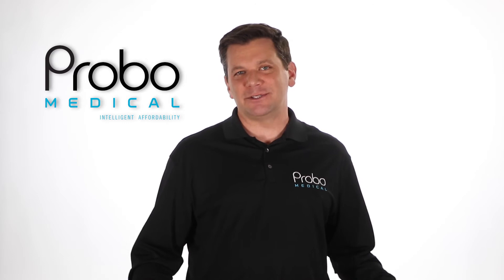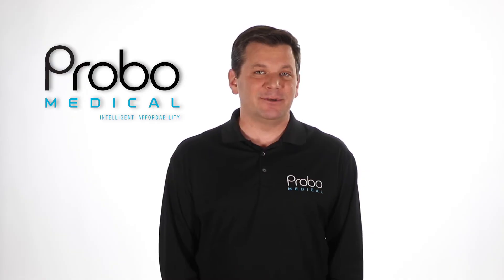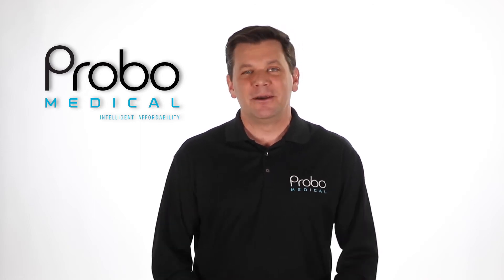The specs on this machine list the depth at a whopping 50 centimeters. And I'm guessing at 50 centimeters that image is absolutely terrible, but you get the idea.